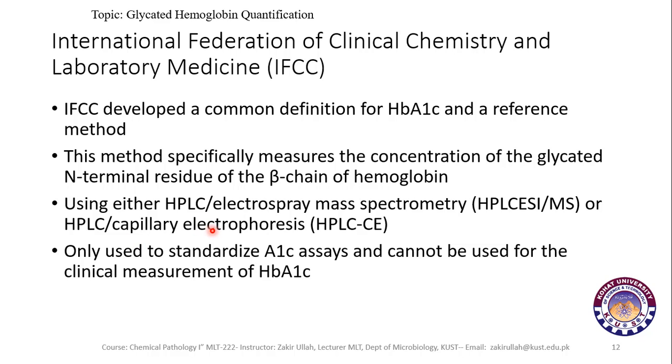These methods were developed by the IFCC for the standardization and measurement of glycated hemoglobin, which measures the N-terminal residue of the beta chain of the hemoglobin.